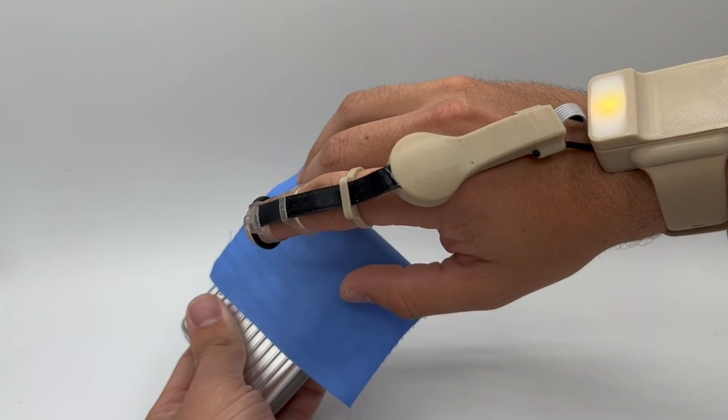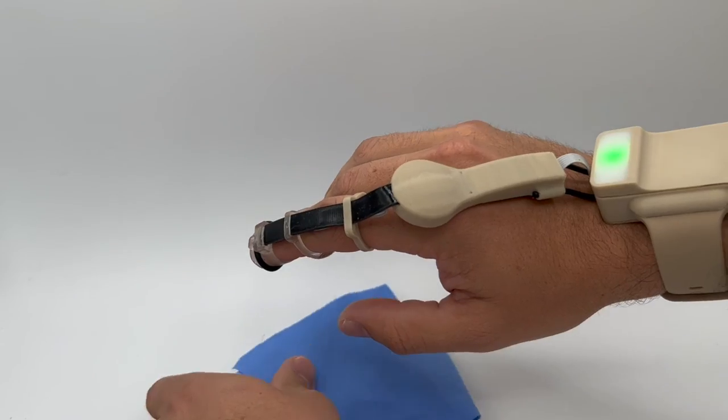As the user slows or reduces their finger activity, the state will change back to yellow and green.